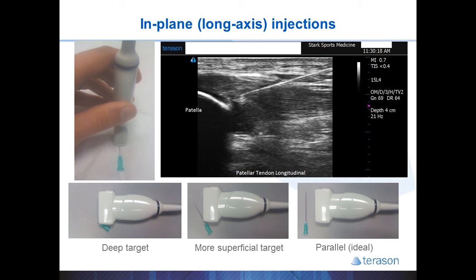In-plane or long-axis approach allows you to potentially see the whole length of the needle from where it enters the skin to the needle tip in the target. This is a much more difficult technique to master, because any slight movements of the probe or needle means you will either lose your target or lose your needle, or potentially lose both. The key to long-axis injection is careful diligence to keep the needle traveling parallel with the probe and keeping the probe anchored to the patient. The angle you take with the needle is according to the depth of the target — the closer the needle is to parallel, the easier it will be to see. More superficial injections will show the needle traveling from the upper right-hand corner into the tendon, and if the needle is completely parallel with the probe, you'll see it very easily as long as the needle is underneath the probe.